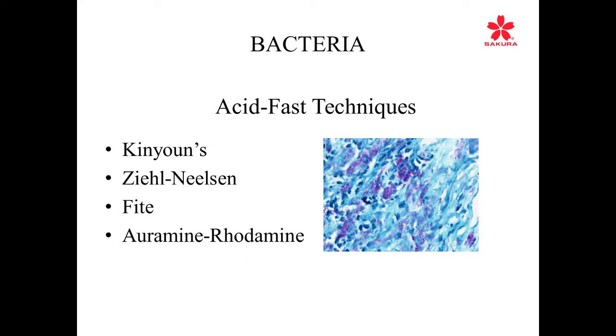Now, let's go back to bacteria and look at the acid-fast techniques that I mentioned. The primary techniques are Kinyoun's, Ziehl-Neelsen's, Fite, and auramine rhodamine. Now, the thing about this is that these carbolfuchsin-based or phenol-based dyes in these three will actually penetrate very slowly, as I mentioned before.